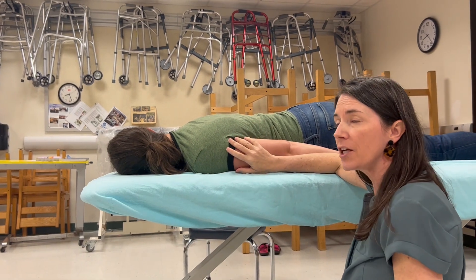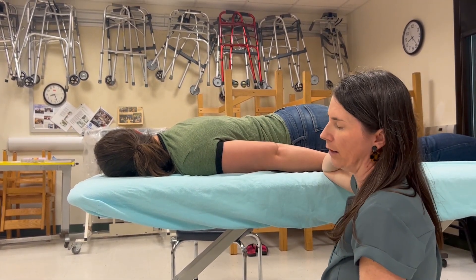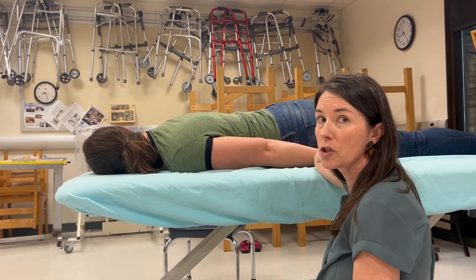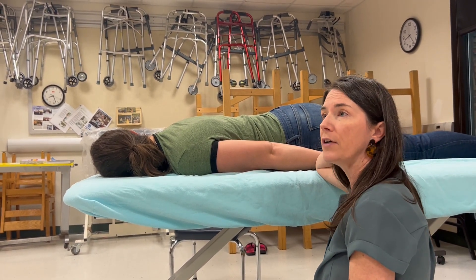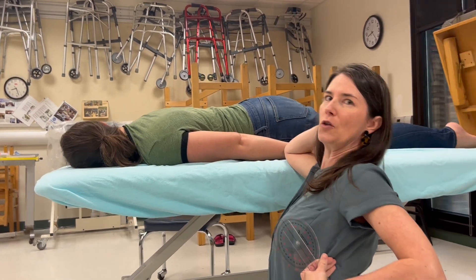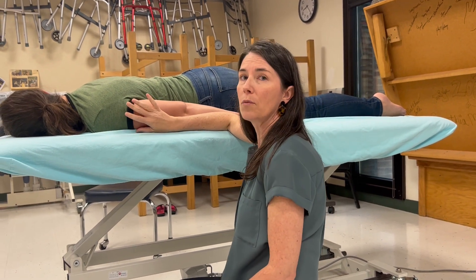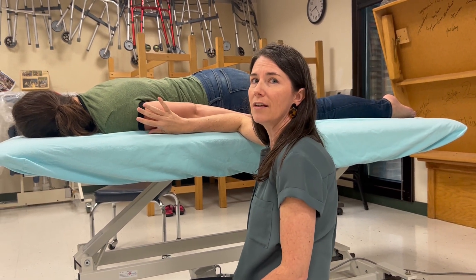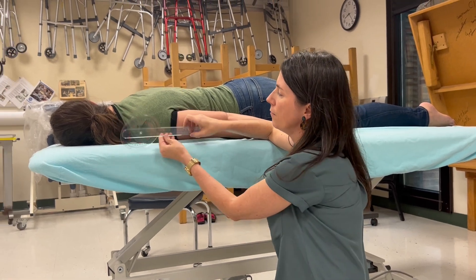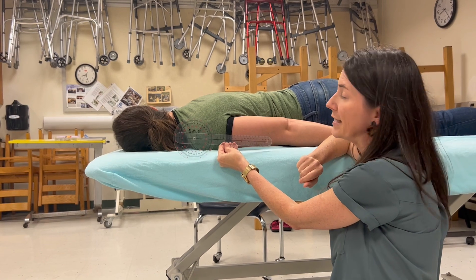With shoulder flexion, the stationary arm is parallel with the lateral midline of the thorax — same thing with shoulder extension. The difference is in supine when measuring flexion, the thorax can arch away from the bed so we have to adjust for that. When they're prone and we're measuring extension, that typically doesn't happen, so the stationary arm is most often just parallel with the bed.